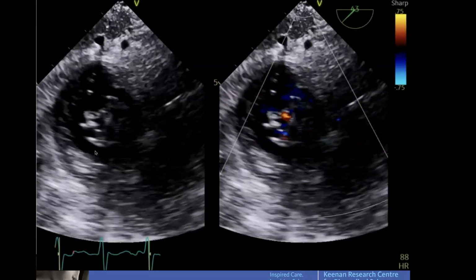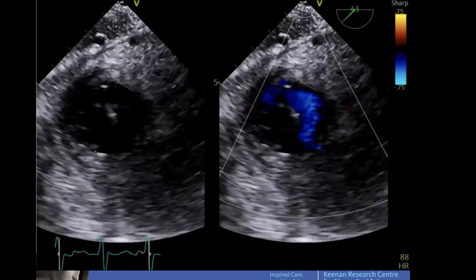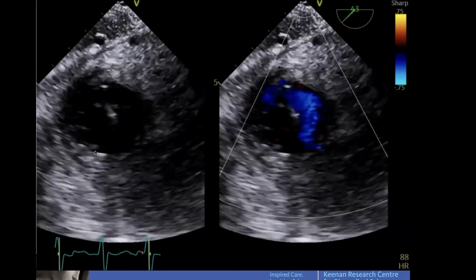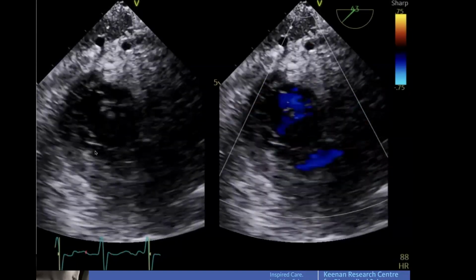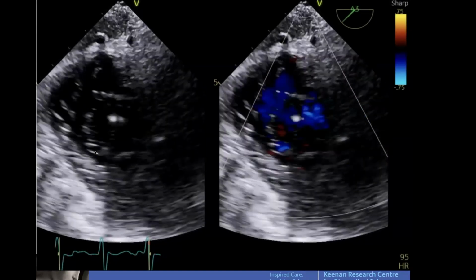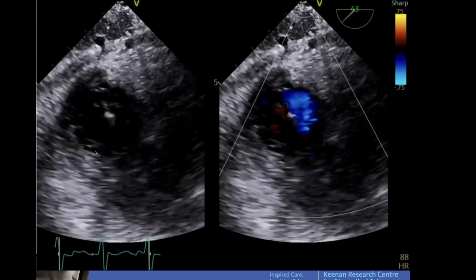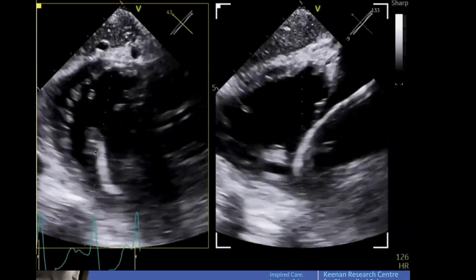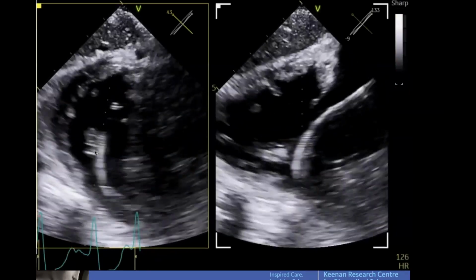Here's one more case, again of another patient. So you can see here the lead is kind of bouncing around. It looks free. It's in the center of the valve. There's TR coming from around the valve. So first kind of clue like, okay, maybe this may not be purely lead related. You can see that, hopefully you can see that it courses anteriorly.